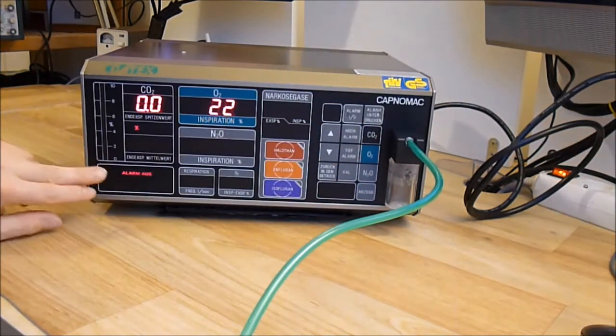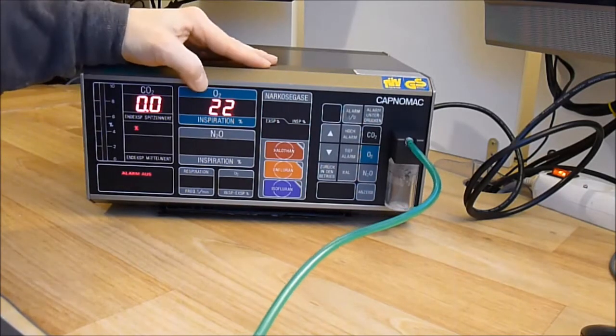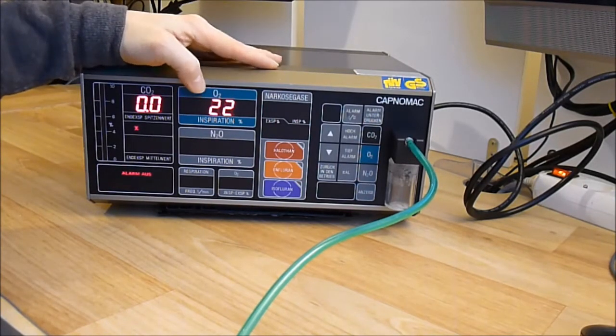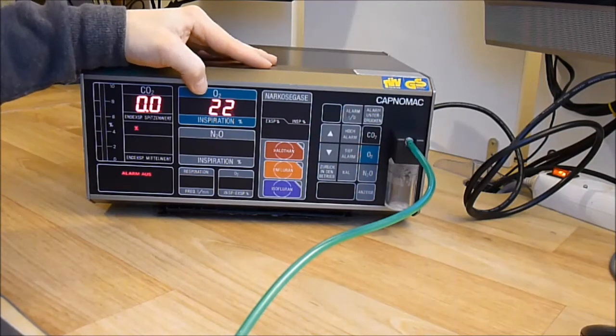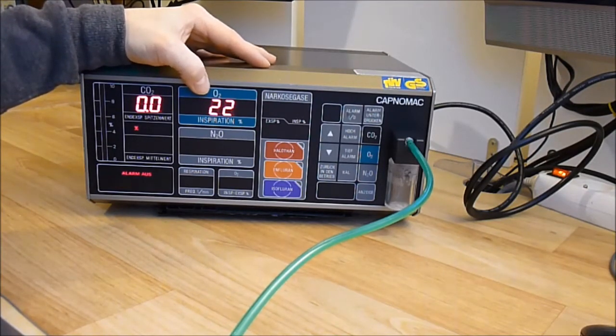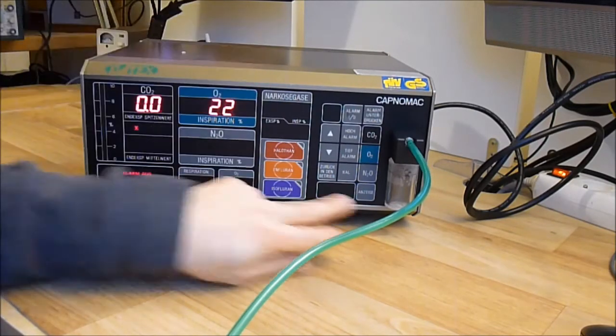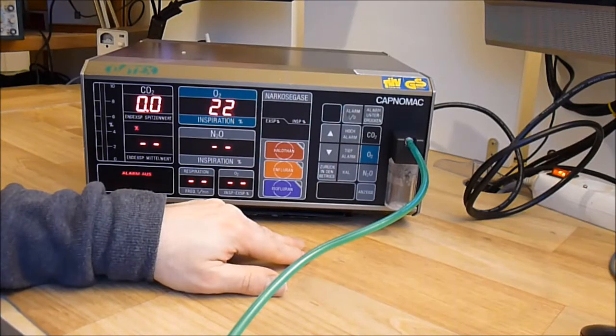So I disable the alarm because it is making noise. So you can see the O2 number here seems about right. It is believed to be 21% of air, so it should be right. I activate the other displays.